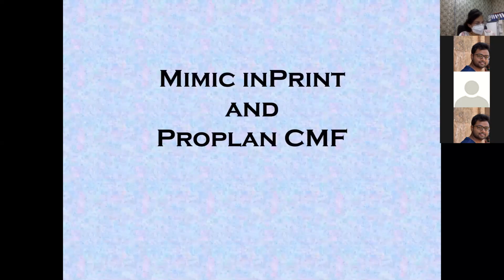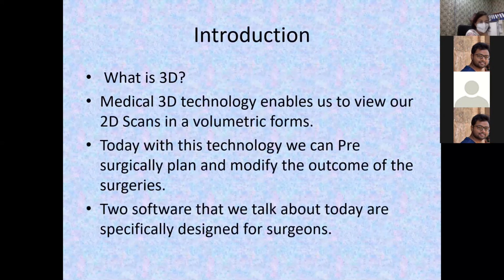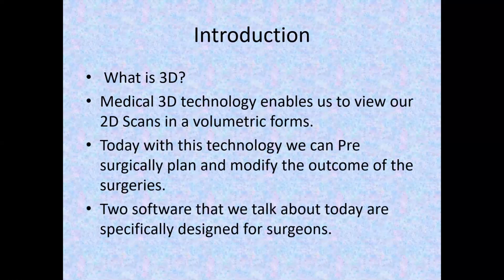For 3D technology. So before we start, what is actually 3D? 3D is basically a three-dimensional or a volumetric representation of our usually two-dimensional scans that we have. So today with this technology, we can pre-surgically plan and modify the outcome of the surgeries.